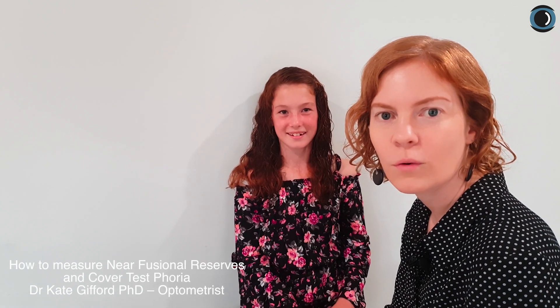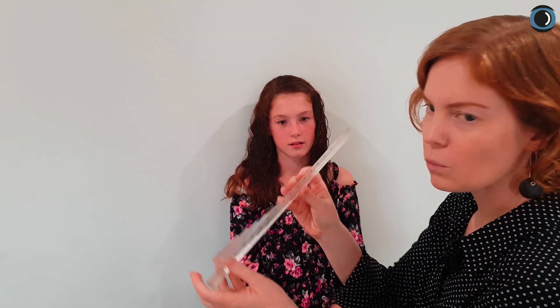I want to show you how to take vergence measurements with a prism bar — it's quite simple. I have my wonderful model Emily with me today, who I've known since before she was born. I'm going to show you how to do these measurements using Emily's eyes, which used to have some problems, but she did her exercises and now she's fine.